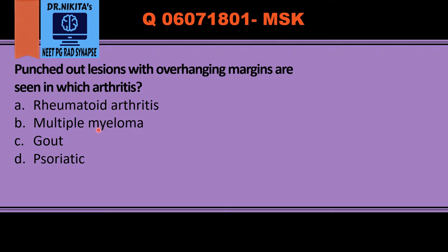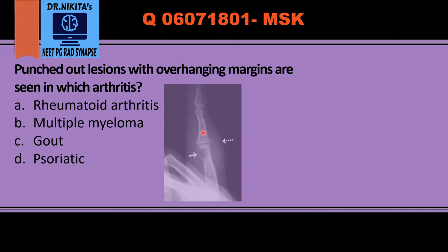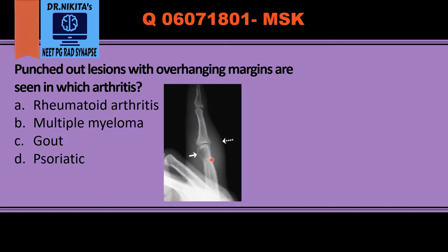This is a feature of gout. On this radiograph we see a lytic lesion — that is an erosion which is very well defined, a punched out erosion, and it has this overhanging margin. That is the feature of gout. Adjacent to that we see soft tissue swelling, which is a tophus of gout.